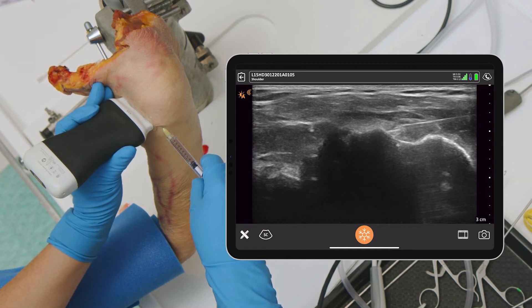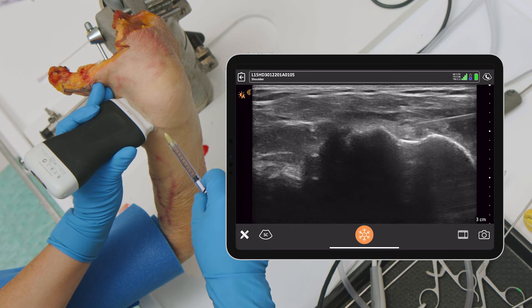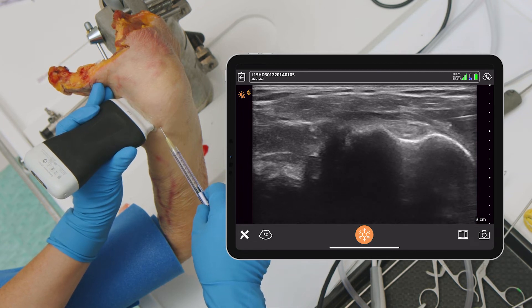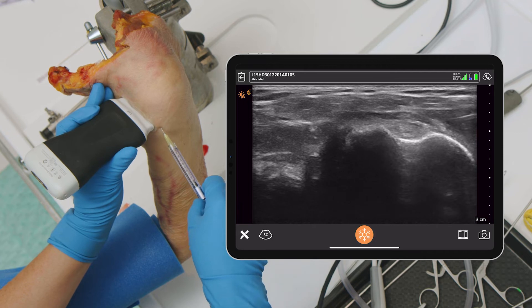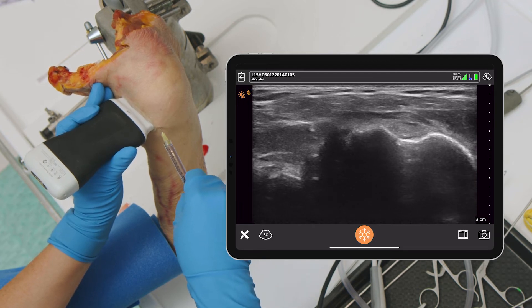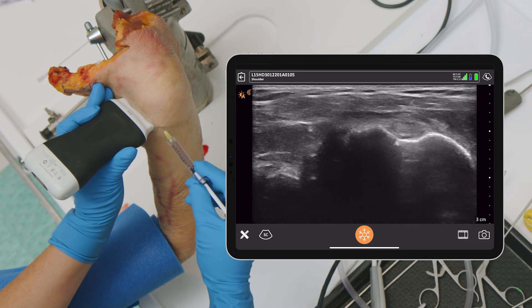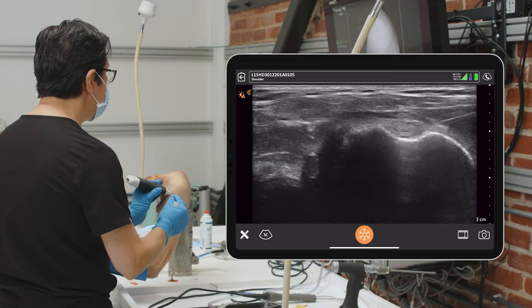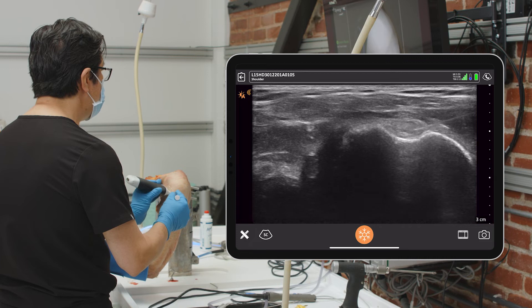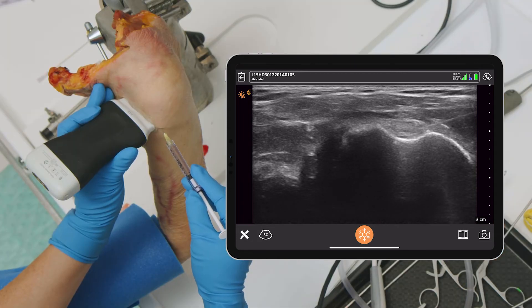You can see you have different options, and make sure you don't hit the tendon itself — but it's very easy to do. So you get in the sheath. Now if you want to inject outside the sheath you can do that too of course. You can just get to the outside of the sheath if you want, or just be in the sheath, which is more commonly done to inject around the tendon itself. So that's one of the easiest ways to get to the biceps if you want to do a bicipital groove injection for the biceps tendon.